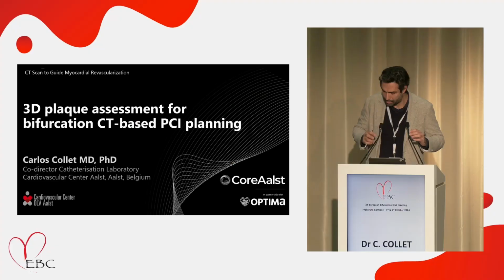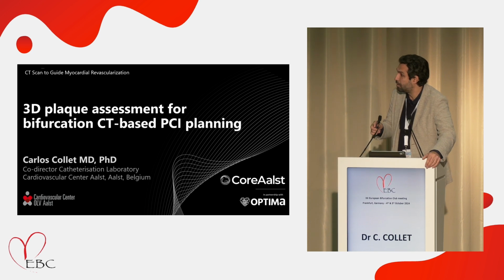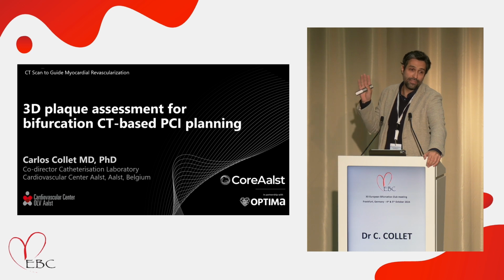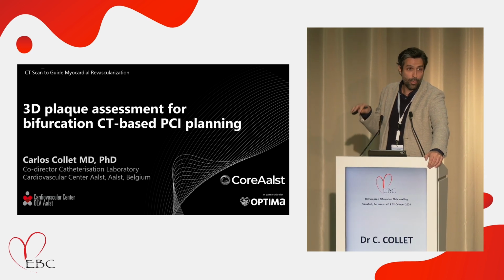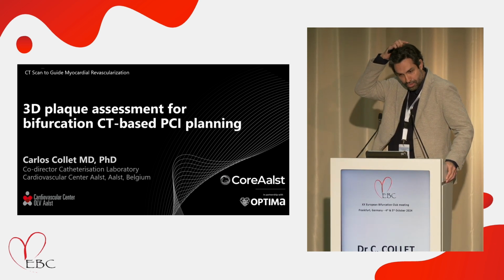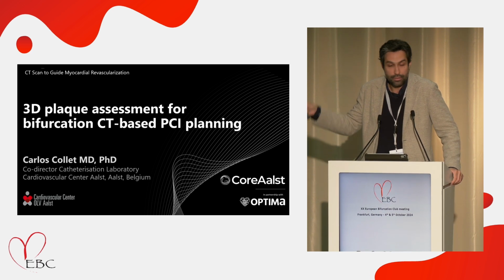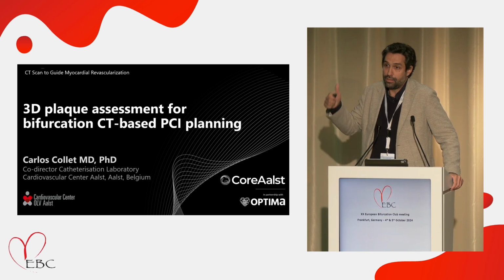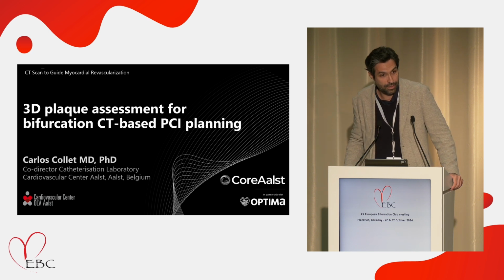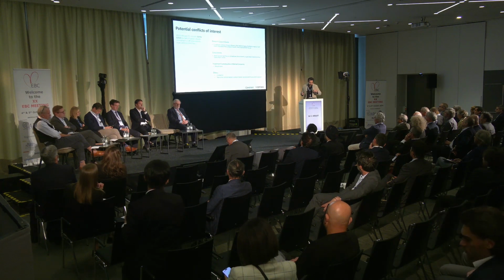Thank you, Professor. And of course, everything that you're going to see in the next slides has been deeply influenced by my time with Professor in the Netherlands. But we're going to now shift to the cath lab. And we're going to make this very practical. And the reason why we're having this session today is because, if you talk with Professor Serruys, he will tell you that he was doing this 15 years ago, and that was true. The thing that is new is that you have this photon counting. Basically, you go to 100 micron resolution, and then you have AI. So this becomes a click in a software, and this is going to show you in the next slides.